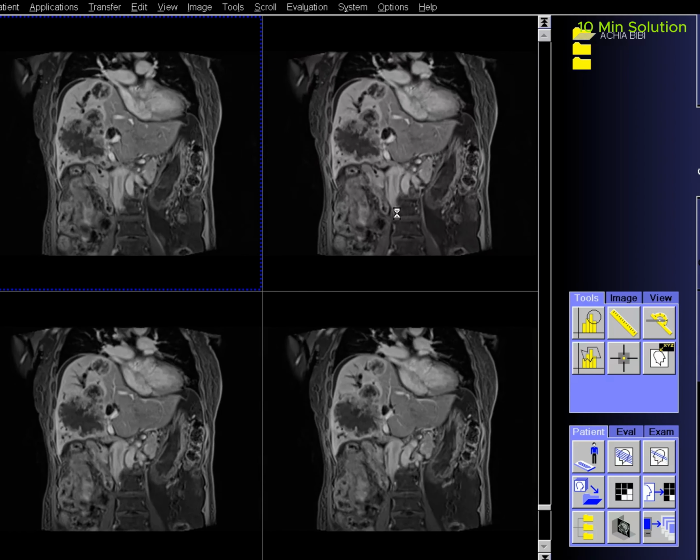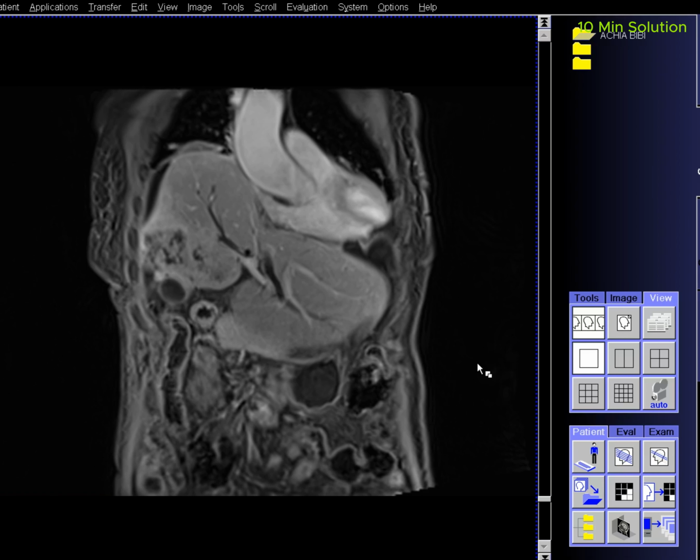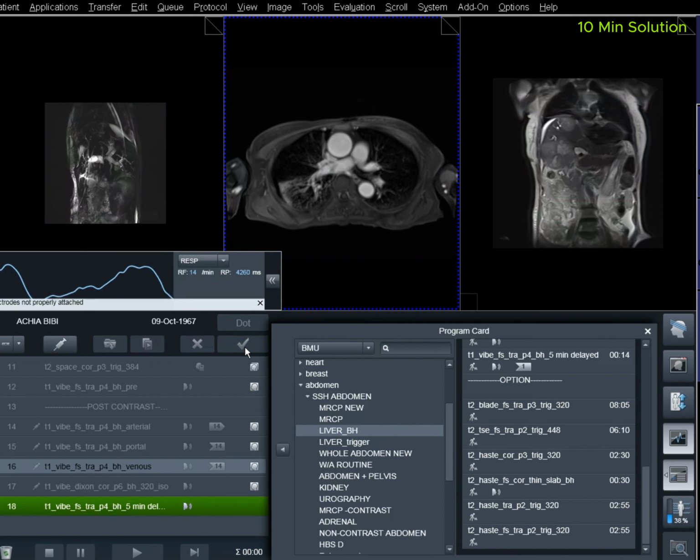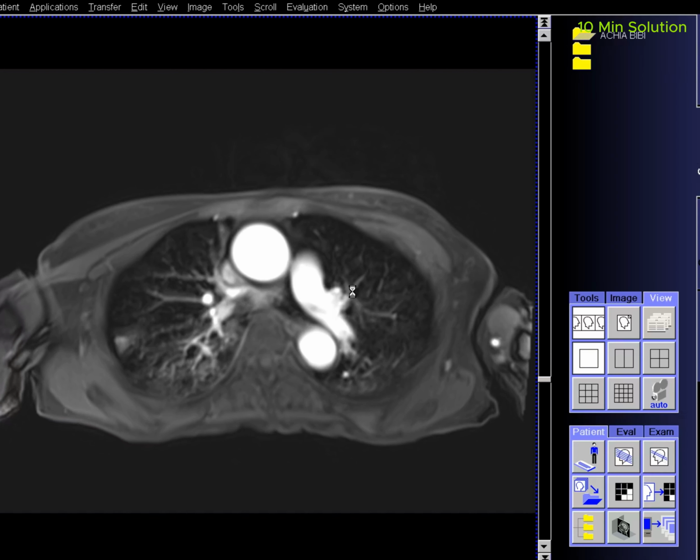Planning care bolus. Plan the coronal care bolus slice on the sagittal plane. Position the block over the mid-heart and angle the slice parallel to the ascending aorta. Verify the position in the other two planes. Determine the suitable angle in the axial plane, aligning it horizontally across the heart. To reduce artifacts caused by breathing and heart motion, utilize a saturation band on both sides of the block.